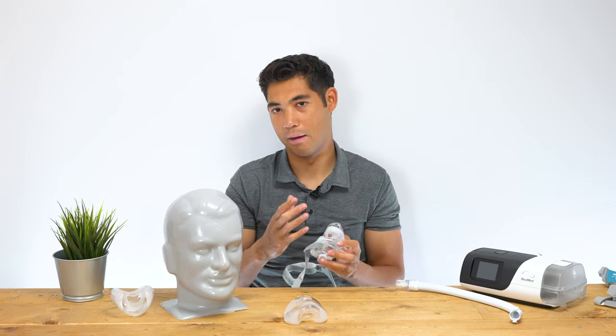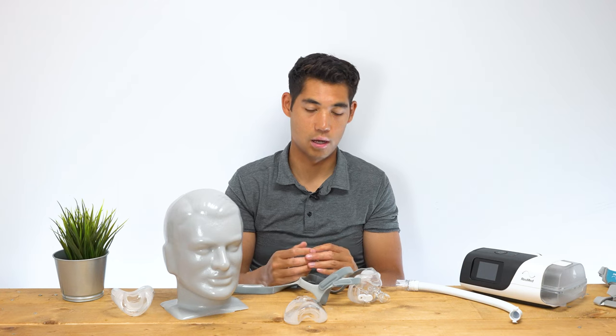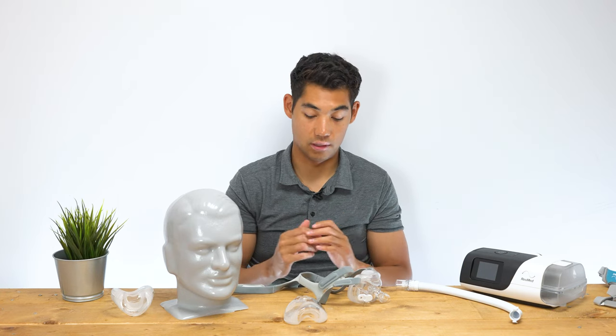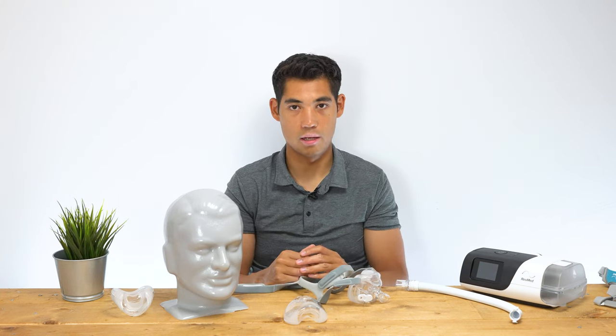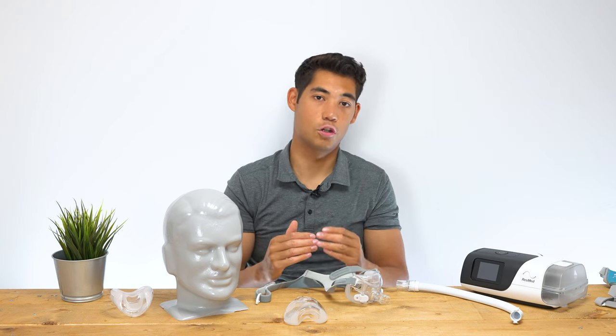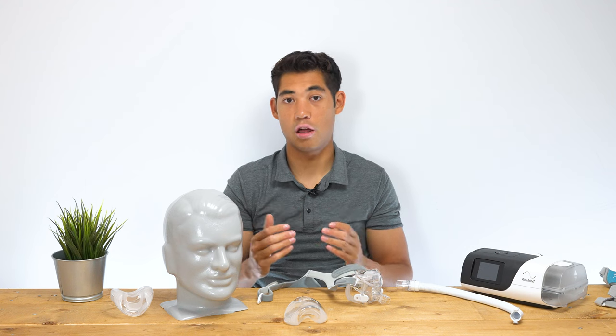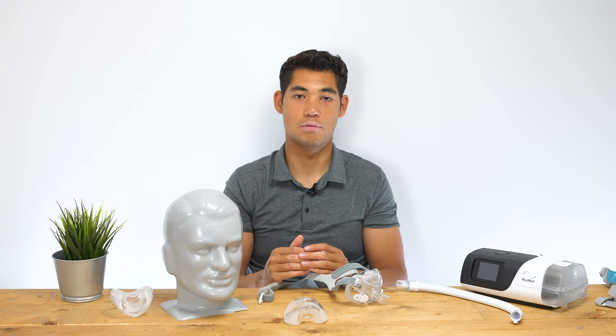For me, I find this is a great mask — it seals really well, the quality of the materials is awesome, and I do like the fact that it's not covering my nose while still being a full face mask. That concludes our look at the Amara View. I hope this gave you enough information to see if this mask is right for you. If you want to check out our other masks, visit our website at cpapstore.ca.